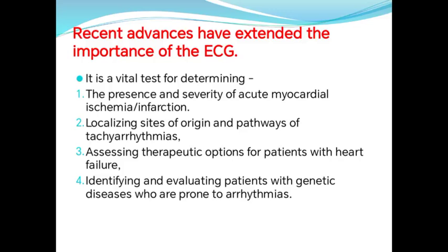Recent advances have extended the importance of the ECG. It is a vital test for determining the presence and severity of myocardial ischemia, and for localizing sites of origin and pathways of tachyarrhythmia. So number one is ischemia.